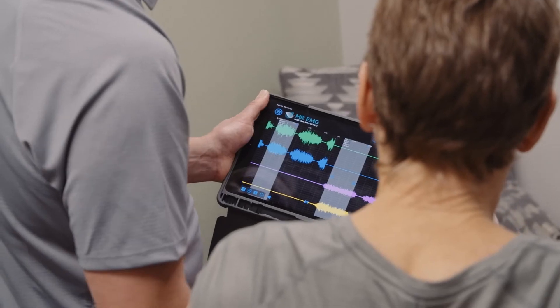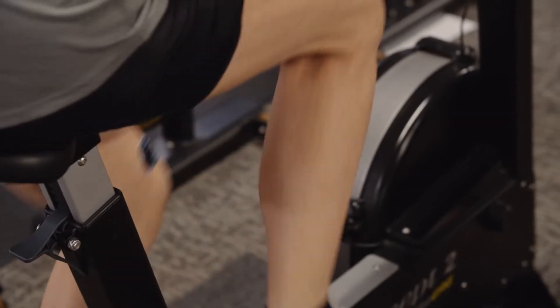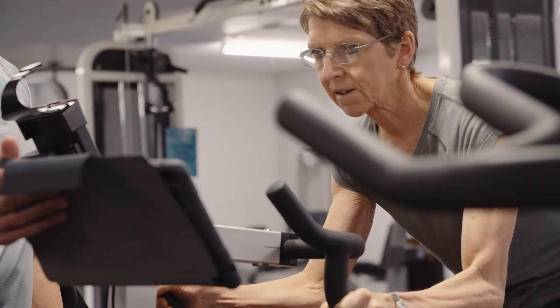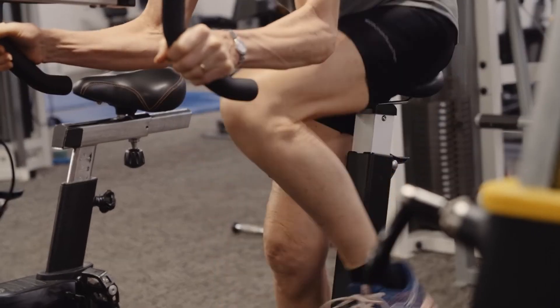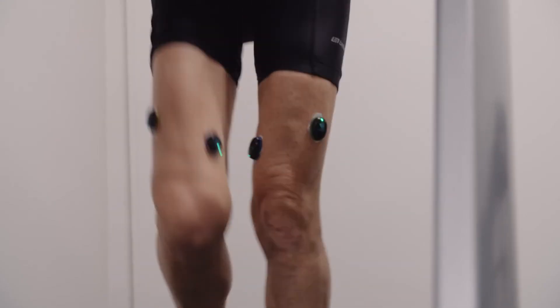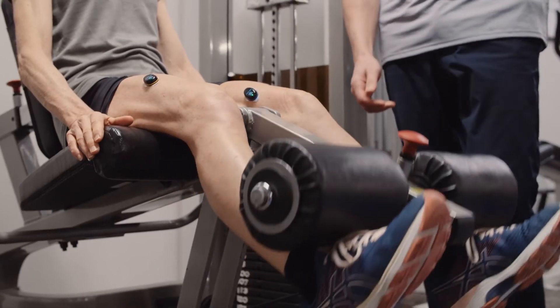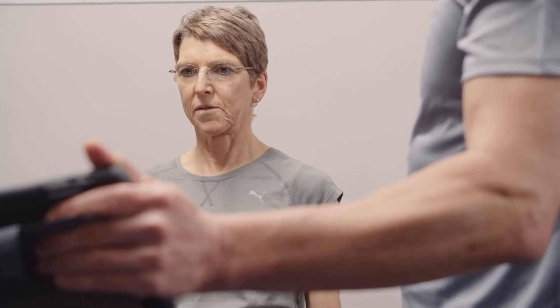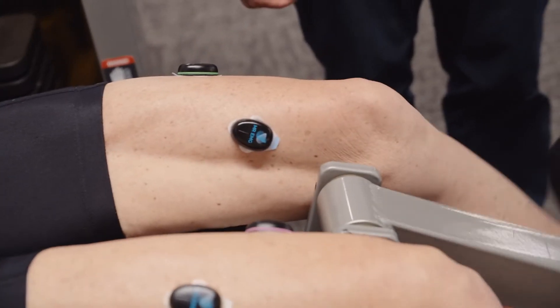Following observations made, test quadriceps output performing dynamic tasks, such as using cardio equipment to see if your findings from one leg extension match active activities. Here we will show the quadriceps muscle outputs using a concept bike erg, followed by a treadmill jog, finishing with weighted leg extensions. The exercises you test are entirely up to you, the clinician, and what you would deem most appropriate for each subject based on their symptoms.